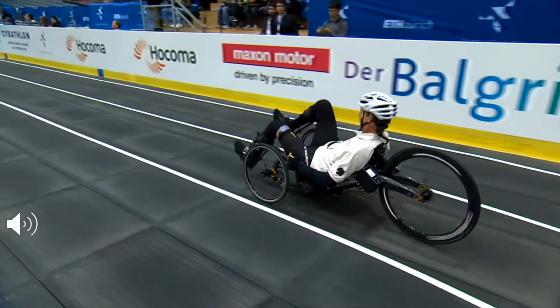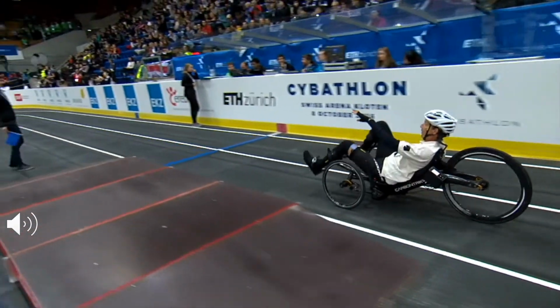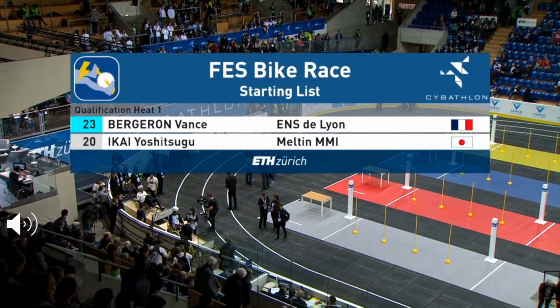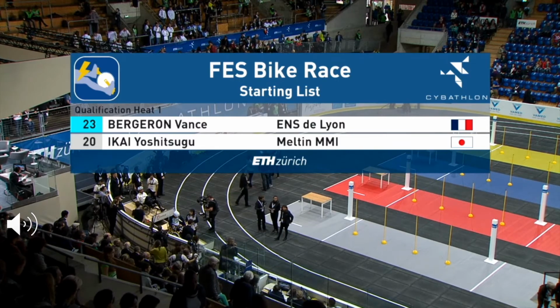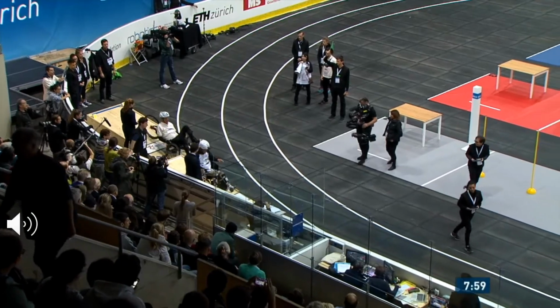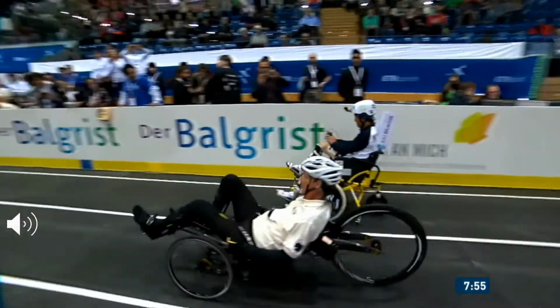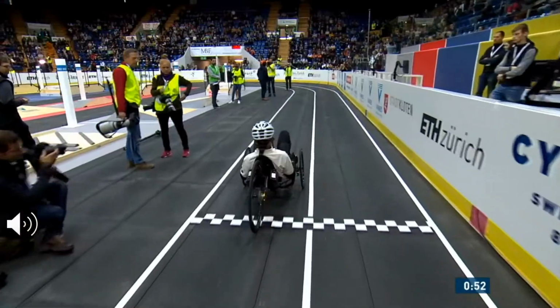What's interesting is that the stimulation is exactly as we described earlier, and I'm on my tricycle competing in the 2016 Cybathlon. What I would like to do is to take special note of the fact that the smooth motion that is produced... Here we find that if you did not know it, you would not think that I was tetraplegic.